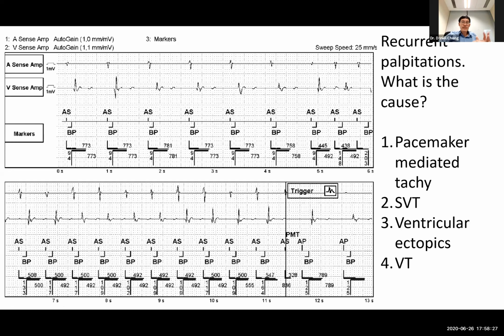And so when it's not sensed, the device would then time out, and there will be an atrial pace at the lower rate limit that is set. Because this particular A-sense is effectively not sensed and therefore not tracked, that is the effect of many PMT algorithms, to omit one A-sense, and in this particular case, that was the scenario. Yeah. All right, thank you.